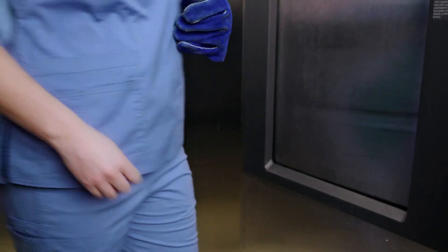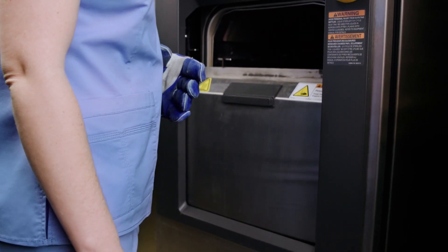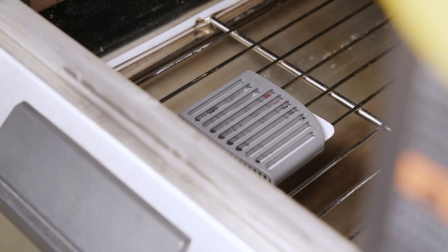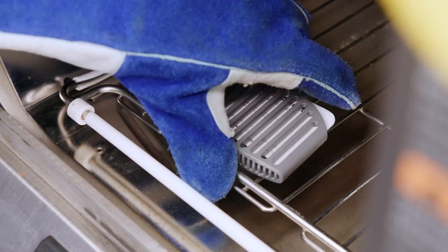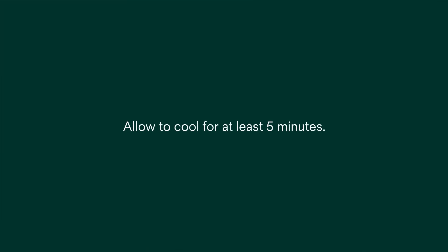Following completion of the BowieDIC cycle, while wearing heat resistant gloves, remove your test card and test card holder from the sterilizer within 20 minutes of cycle completion. Remove the test card from the holder and allow to cool for at least 5 minutes.